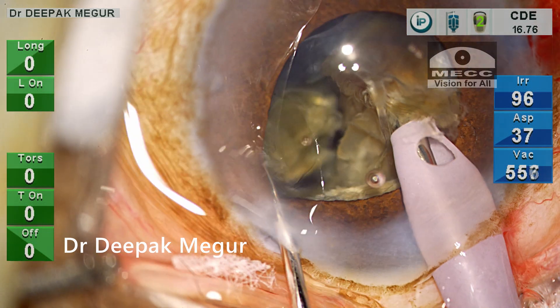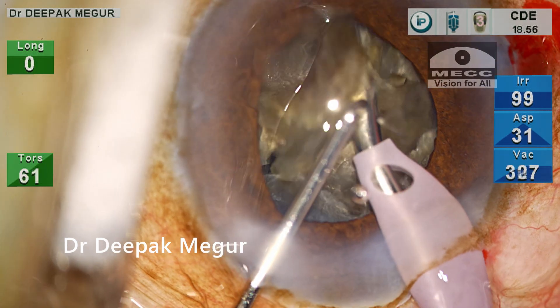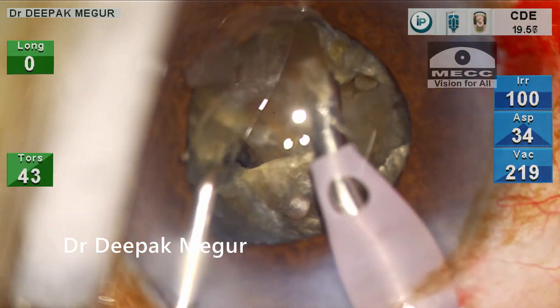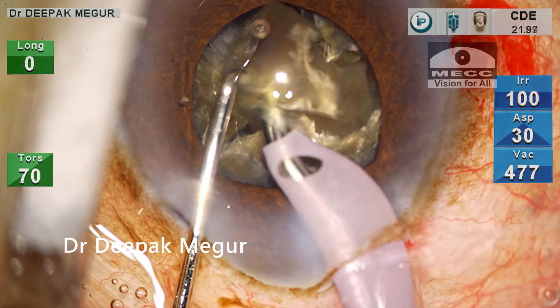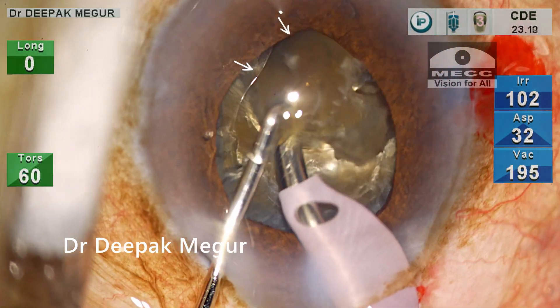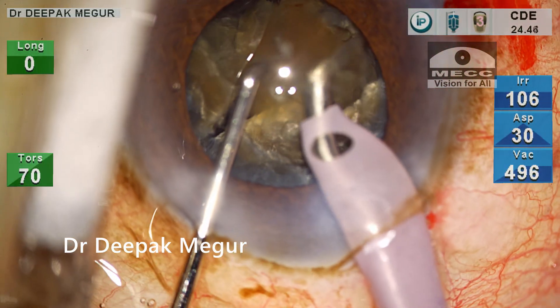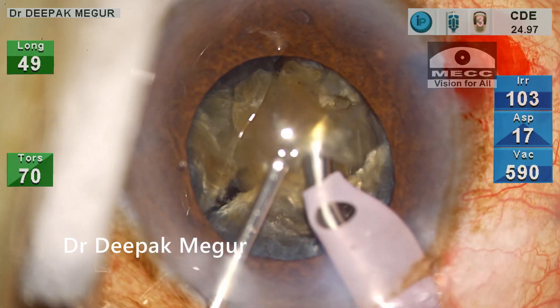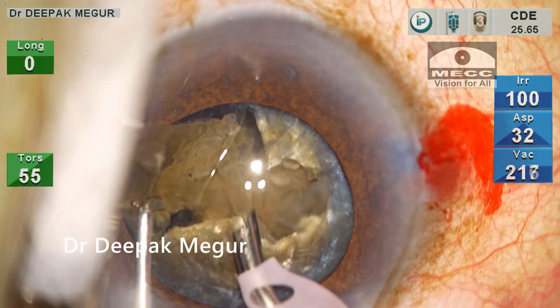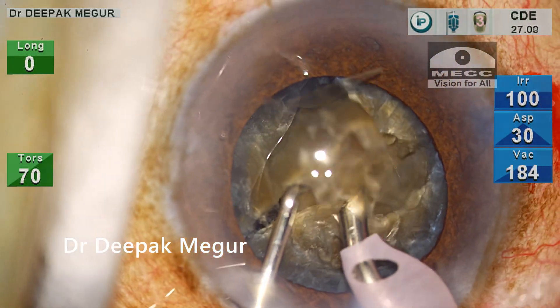The settings are changed, and the quadrant is carefully emulsified at the pupillary plane.